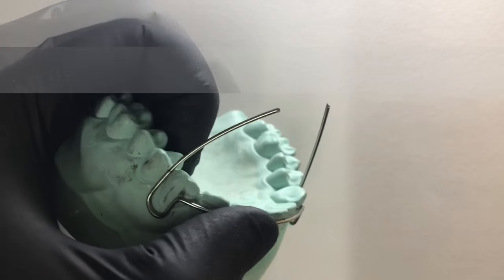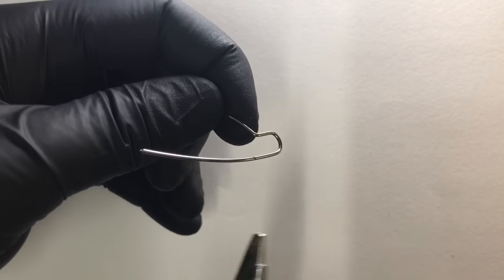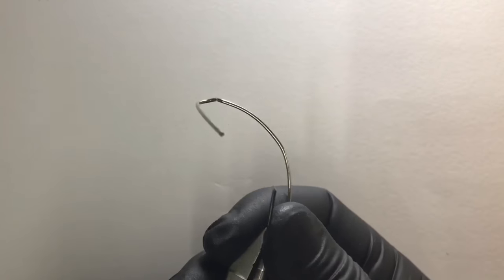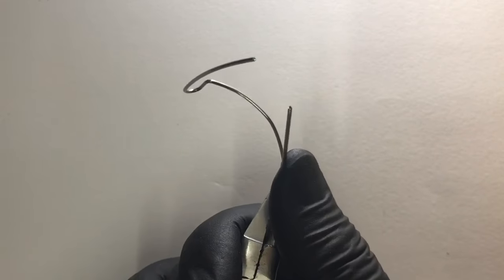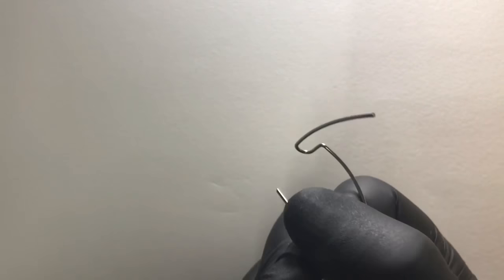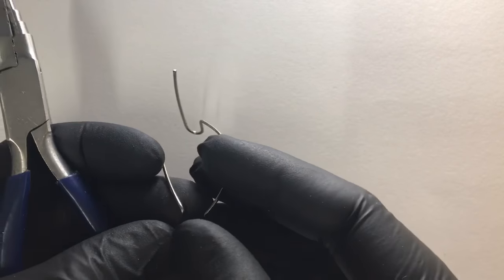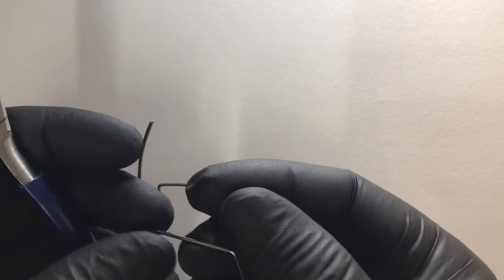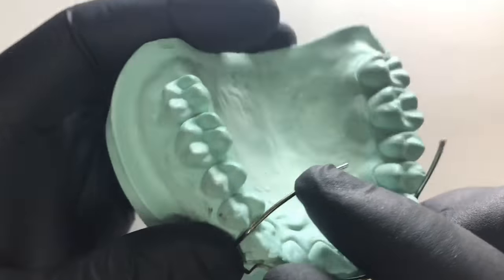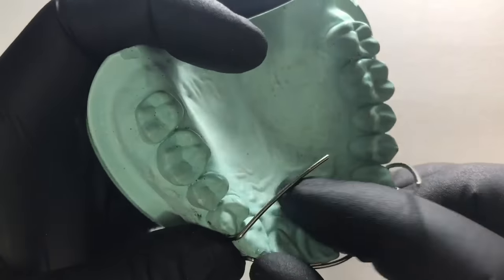Now we need to give two points where we will be adapting for the palatal adaptation. Engaging at the square beak of the universal plier and giving a 90-degree bend. Now we need to check whether it is going into the embrasure — yes, it is going perfectly into the embrasure.